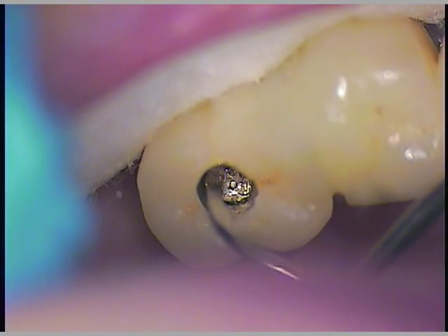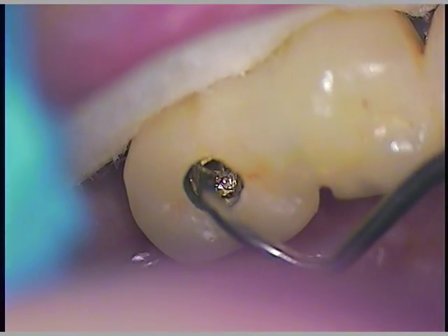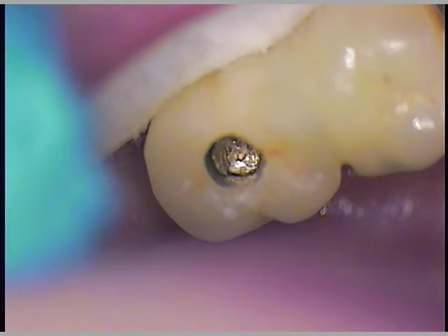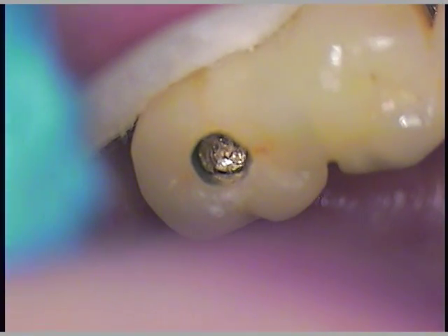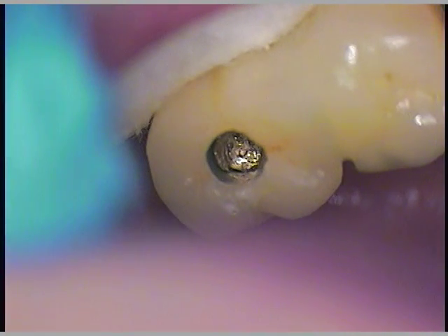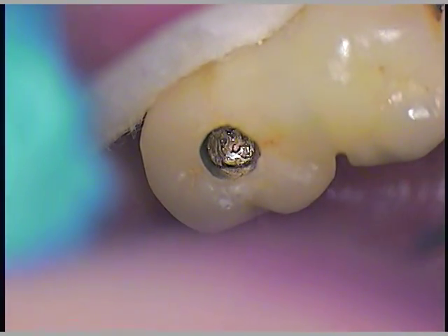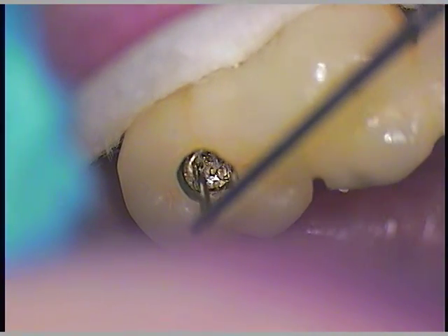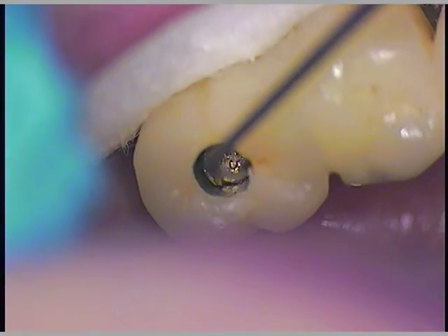You can see how that screw was worn on one side. That's worn for a reason. That means the operator was trying to go in there and desperately trying to remove it, but it was deviating off to one side — it didn't really have a way of centering. We're developing centering.